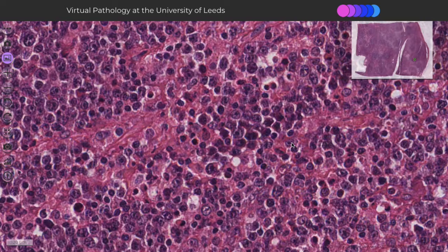An additional note of caution on that point is that embryonal carcinomas are usually positive for CD30, and certain B-cell lymphomas, anaplastic lymphomas, can be positive for CD30 as well. So it is not wise to rely 100% on a single immunohistochemistry like CD30. So always do a panel of immunohistochemistry if you need to do it. For lymphomas, you expect that these cells will be positive for CD45, and depending on the actual subtyping, you'll see a different pattern of positivity accordingly.